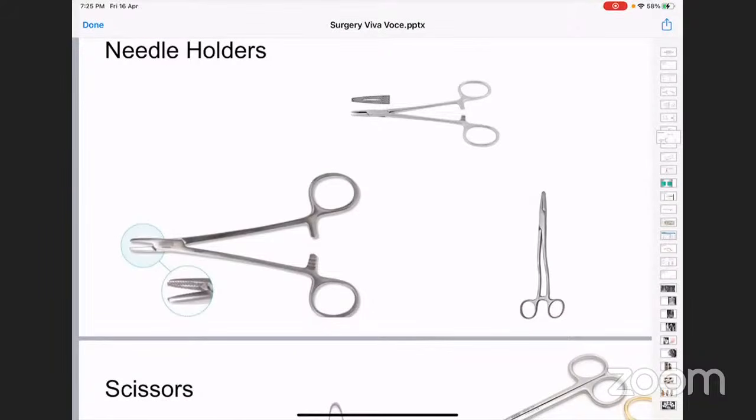And when you are inserting your fingers, do not insert the fingers all the way up to the base. So hold it somewhere near the middle phalanx or even the proximal interphalangeal joint. Do not slide it all the way, because when you have to transfer the instruments or change the instrument, change the grip, it becomes very awkward. So these are little things that you learn by doing or watching keenly.